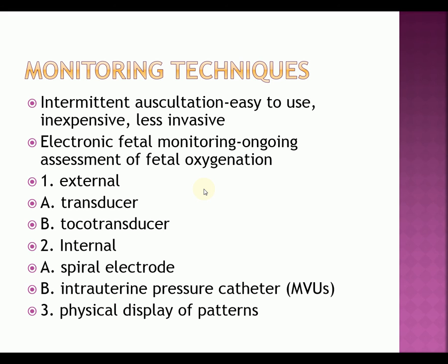So this intrauterine pressure catheter has a pressure sensitive tip, and we've talked about millimeters of mercury already, and how it can objectively measure the frequency, duration, and intensity. You should be able to use this to evaluate the adequacy of uterine contractions more so than if you were palpating them, as we talked about with the Montevideo units and how to use them. So be sure that your Montevideo units do not exceed 250, although they can.